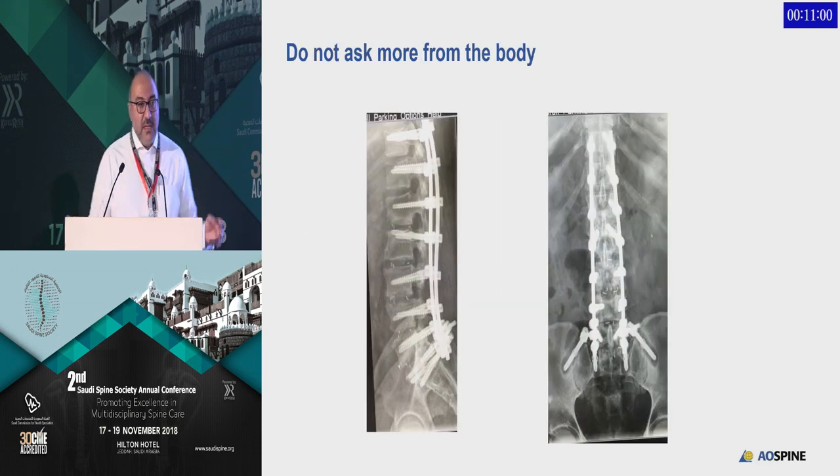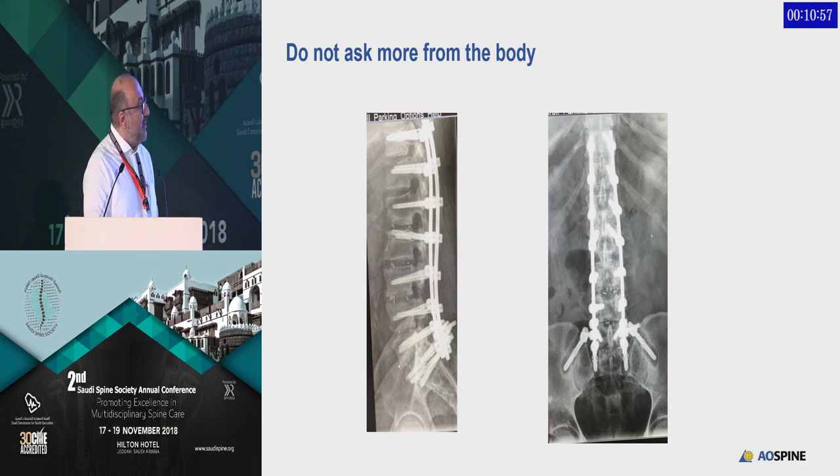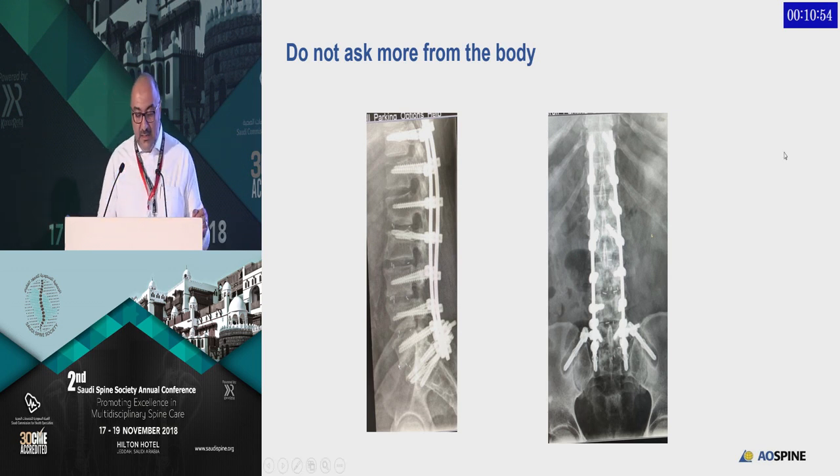Like in this case, you see, I did it with minimally invasive surgery, and I did TLIF at least 5 levels. Also, because this patient had some osteoporotic issues, I put in expandable screws and I put the side screws here. But because I forced the correction of the sagittal balance, I was looking for perfection, I ended up with loosening and severe pain. So I had to take the patient back and remove the side screws. I don't recommend side screws anymore when you do a surgery to correct sagittal balance with a long segment fixation. It's better to use sacroiliac fixation in this situation.